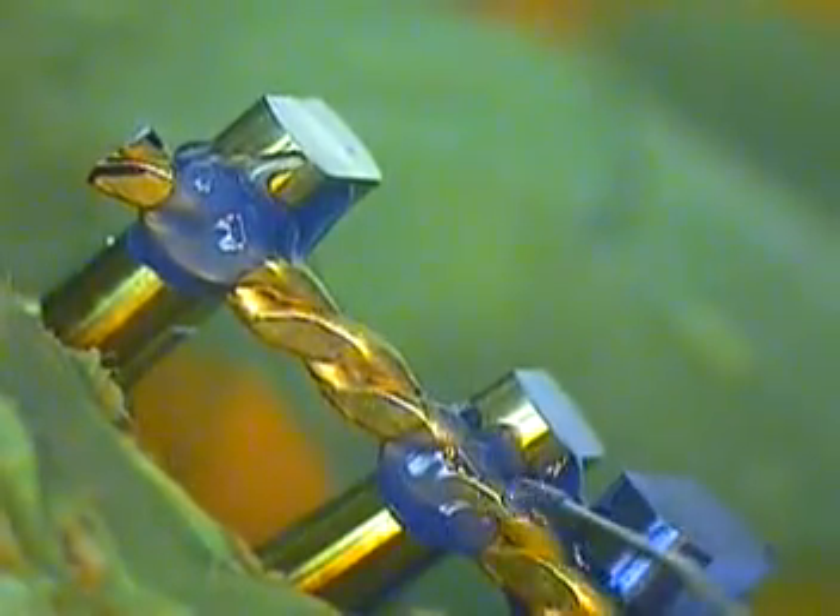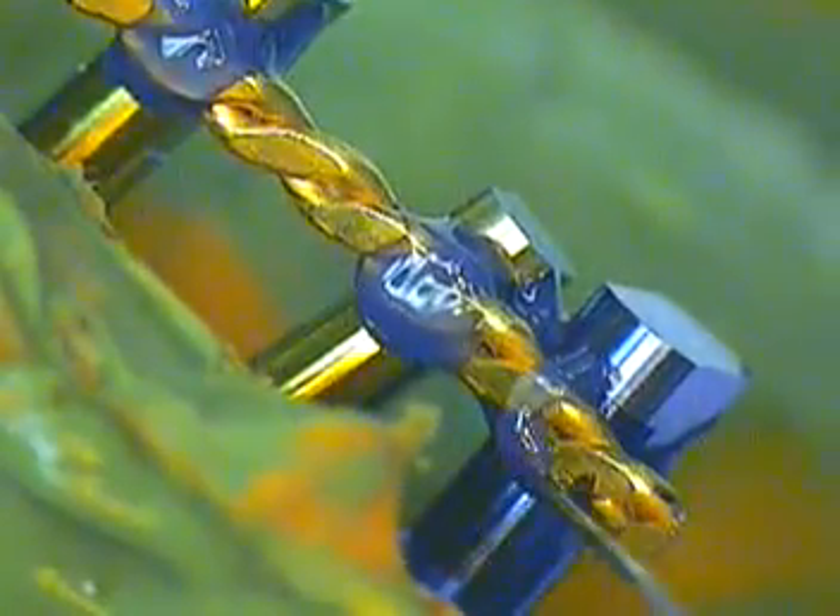In the mouth I do the same thing. It doesn't take but a couple minutes to do this, really. It's not that difficult. You have good retraction, and if your patient's sedated it's even easier. An open tray impression, folks, is really the best way to do implant dentistry. It is so demanding that we have absolutely zero problems with fitting cases — not only to the model, but to the mouth. And when you can cut your time all the way down to just five or ten minutes of seating a case, if I have two or three screw retained teeth in a row, I know they're all going in passively without any pressure on the screws.